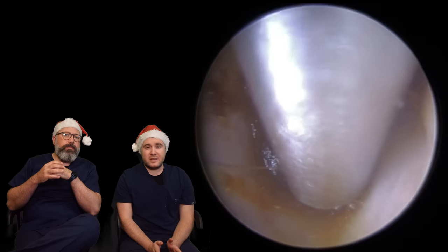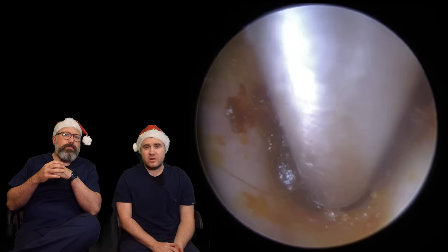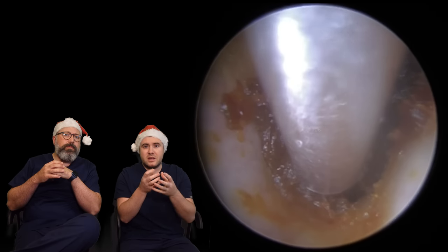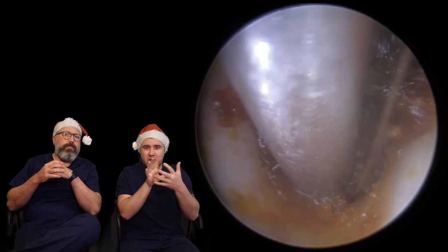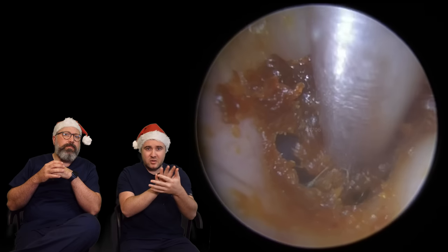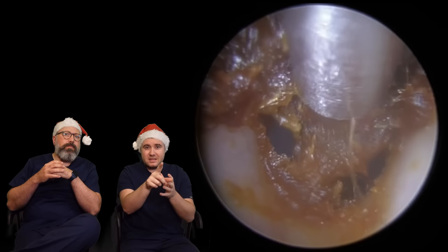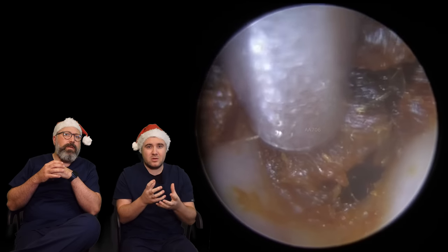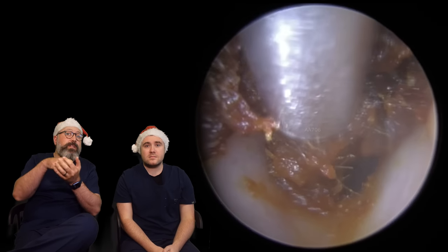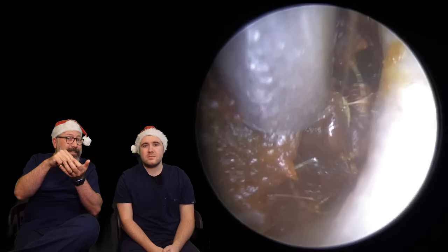So it's not always easy ones to do. Now, obviously we're very, very deep here, but I am sticking with the standard size on the tube. The reason for that — because it is so sticky, you can see little bits suctioning into the tube there. I want to try and get a really good suction grip on this last plug that's in there, in the hope that we're going to be able to lift all of this out. And you can see all the sides there are starting to come out, so it's done what I wanted it to do.